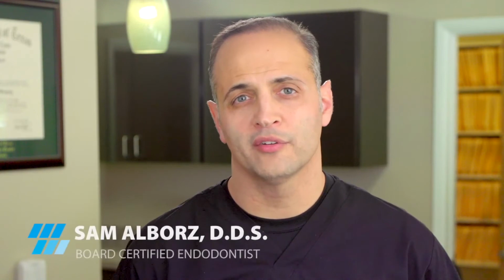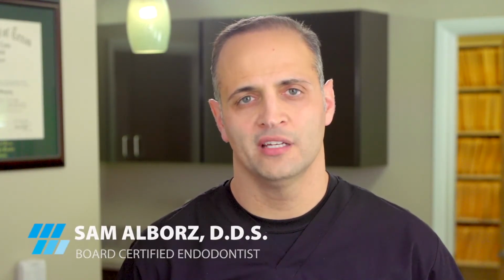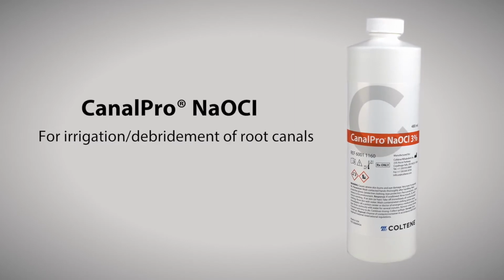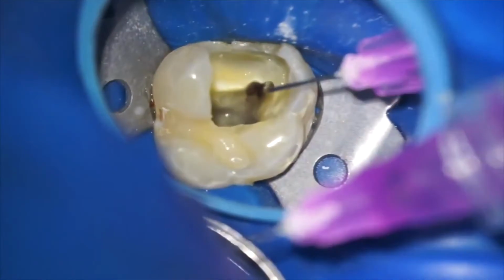Irrigation is very important in removing the microorganisms that have invaded the canal space and disinfecting the root canal system. Primarily, we use sodium hypochlorite as our primary disinfectant or irrigating solution.